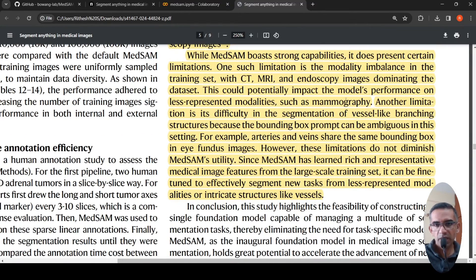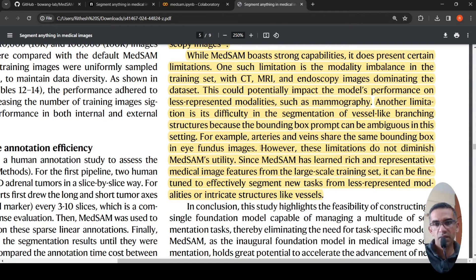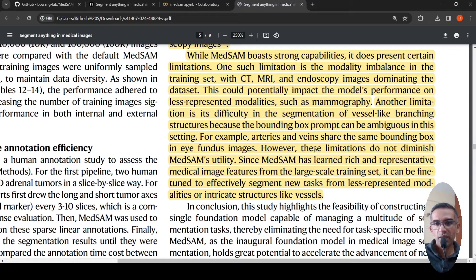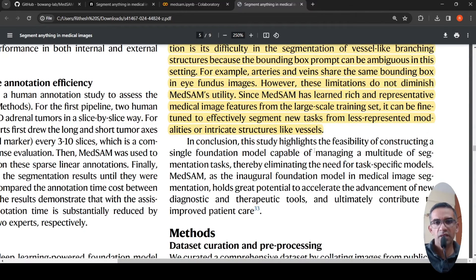Another limitation is segmentation of vessel-like branching structures, where the bounding box prompt becomes ambiguous because arteries and veins share the same bounding box in eye fundus images. However, MedSAM has learned rich and representative medical image features, and further fine-tuning can improve performance in these cases.